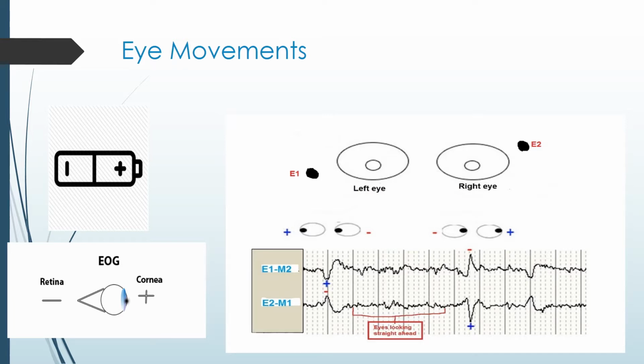Now let's assume we have the left eye in channel 1 and the right eye in channel 2. That's what is pictured in front of you, which is slightly different than what our other tracing looks like. But in this example, the left eye is on top and the right eye is on bottom.